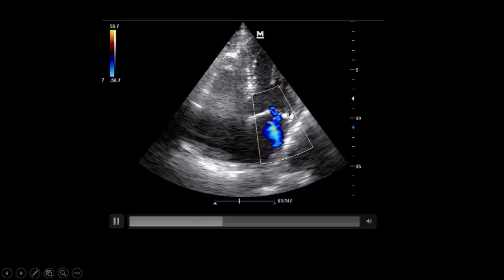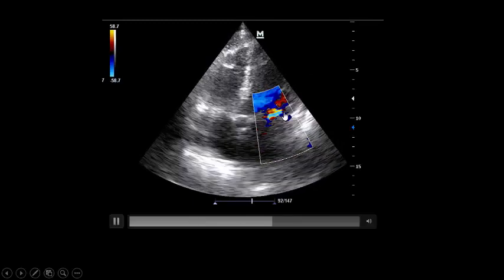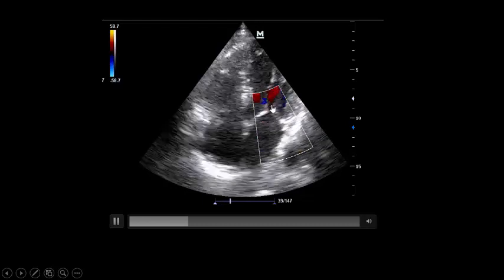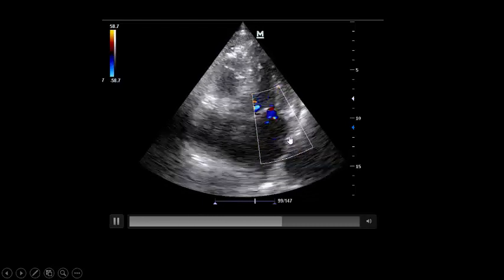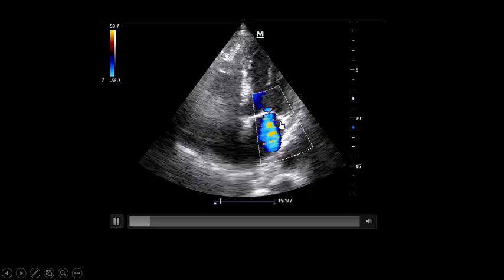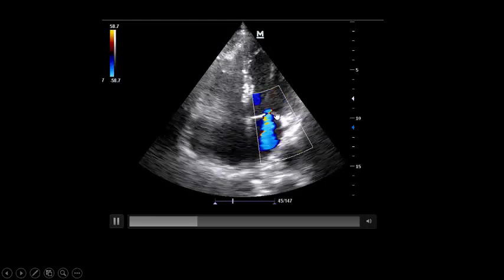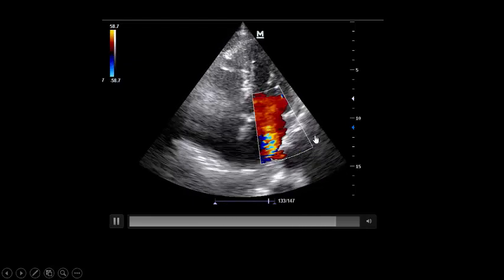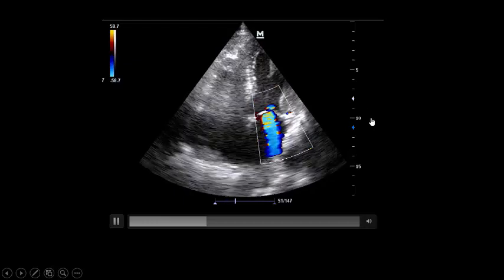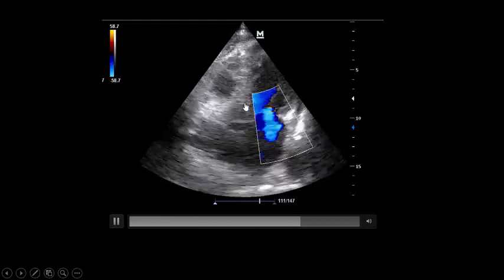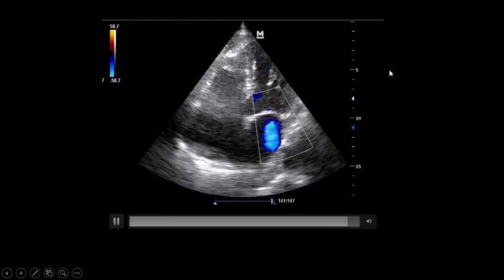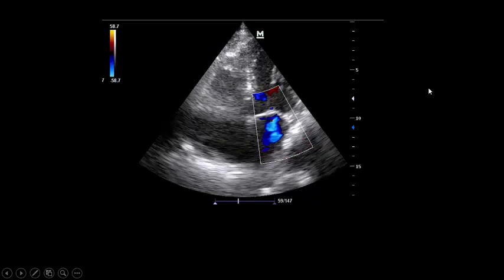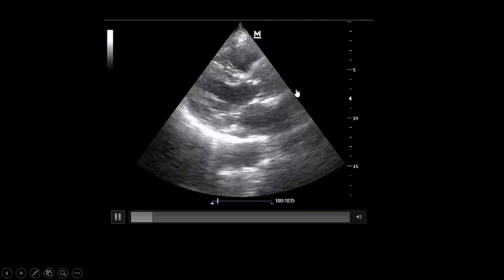Now with color Doppler on the mitral valve, you are seeing moderate mitral regurgitation. The direction of the mitral regurgitation jet is towards the posterior leaflet, which means you are talking about ischemic pathology. The ejection fraction on visual assessment is approximately 50%.